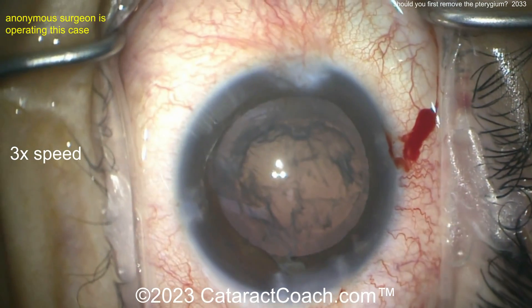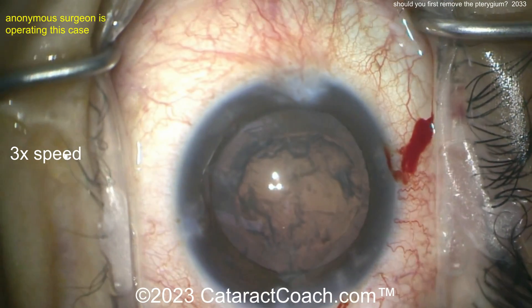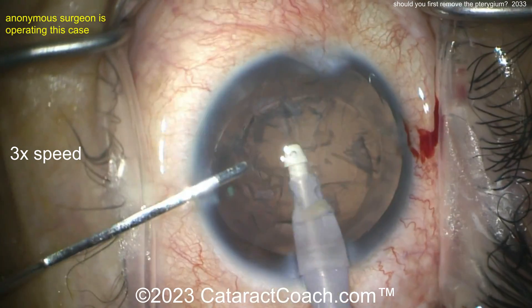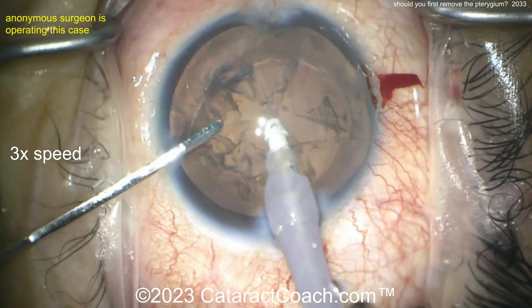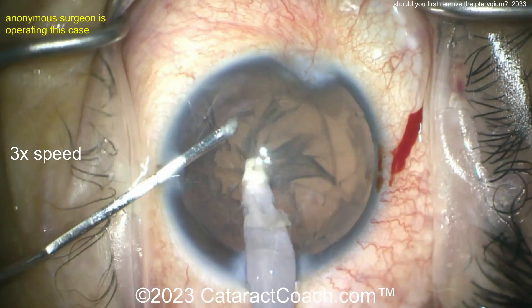But this patient, as you can see, had a pretty modest cataract — the nucleus is relatively soft — and this patient probably wants a pretty good refractive outcome. So in a case like this, I'd say you should probably remove the pterygium first, let it heal up a few months, then come back and do the cataract. That's the optimal way to get a great refractive outcome.